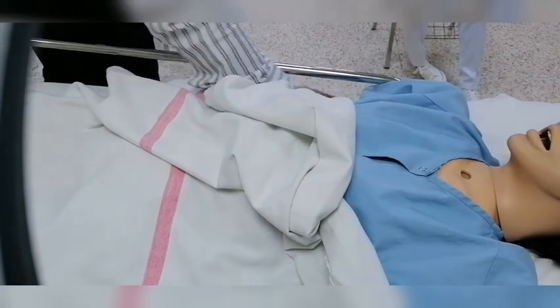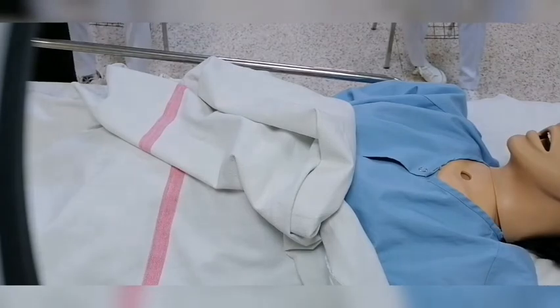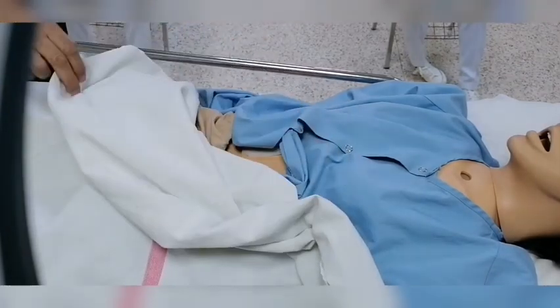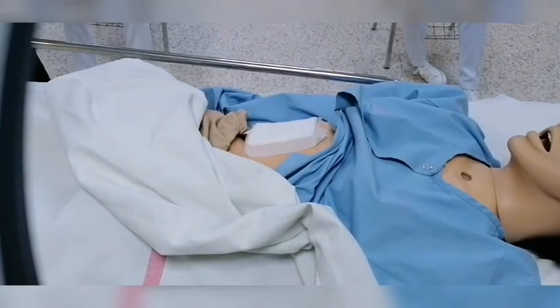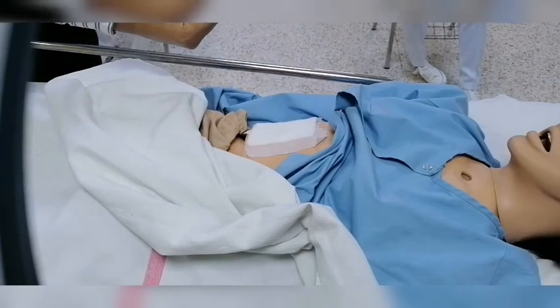Then after that, we verify, we prepare our equipment. We have to expose the dressing to find out where the site of the wound is. So here, the client is having a wound here in his abdomen. It might be a post-operative surgery. What do I have to do before removal of that wound dressing?